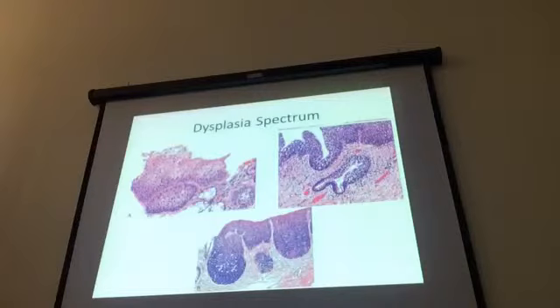It's still okay if you would like to use mild, moderate, and severe. You tell me which one is moderate, which one is severe. This is the challenge, that sometimes one person's moderate is another person's severe, and so these are difficult. But this is to be expected in the lesions in this area. And this is particularly true for the non-keratinized squamous surfaces of the anal canal. So these types of appearances would be like non-keratinized mucosa in the vagina or cervix.